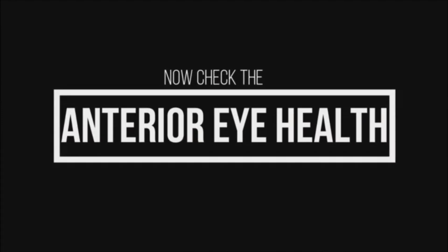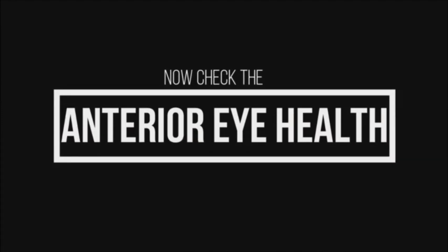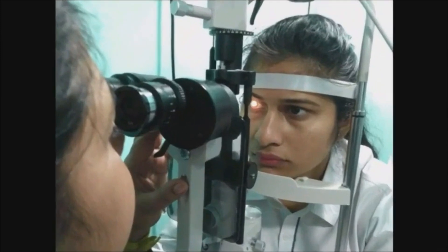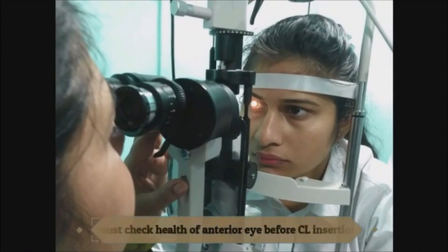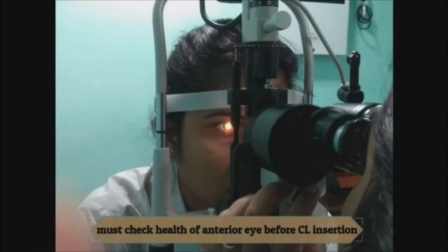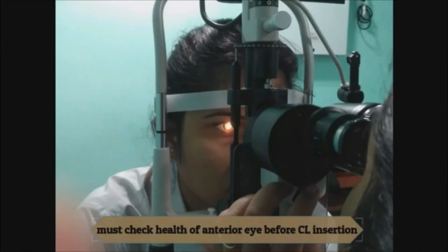Now while examining the anterior eye health, we check the ocular status of the eye starting from the lid margin to the posterior surface of the lens.